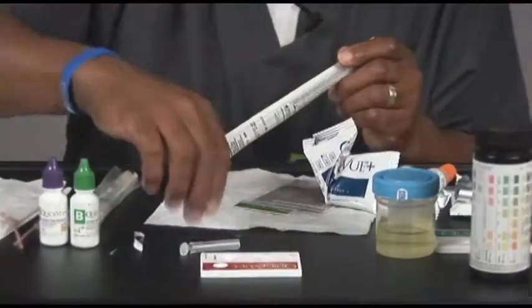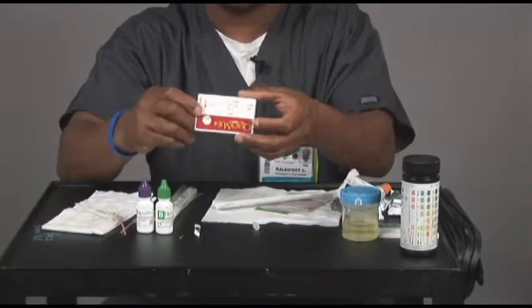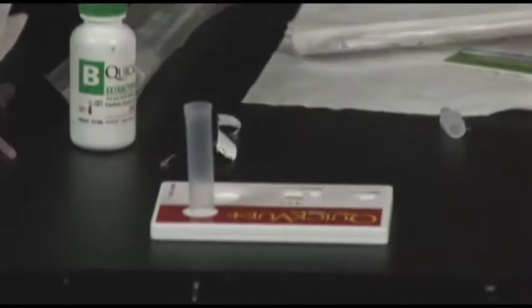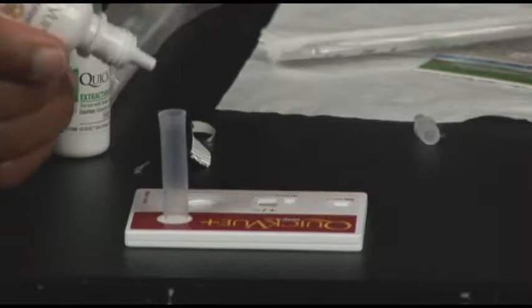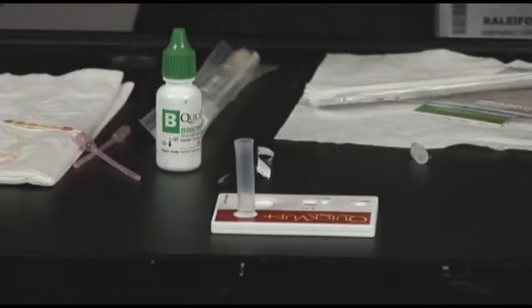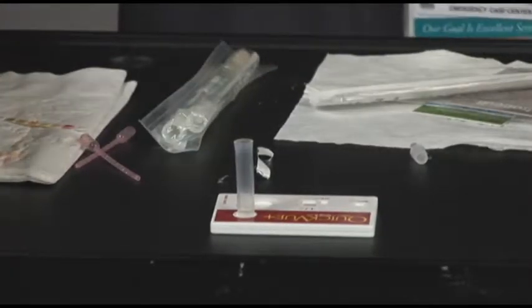You get the test tube, here goes in the round circle here. There's a circle to hold it for you. This is going to be your holder. That goes there. You're going to put in 4 drops of reagent A. 4. And 4 drops of reagent B.